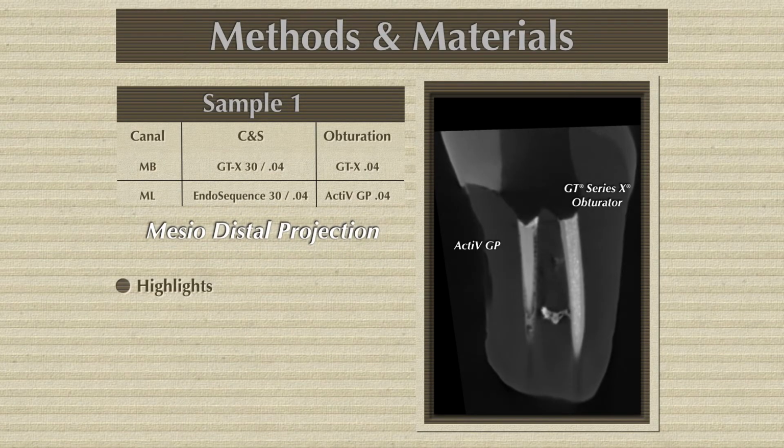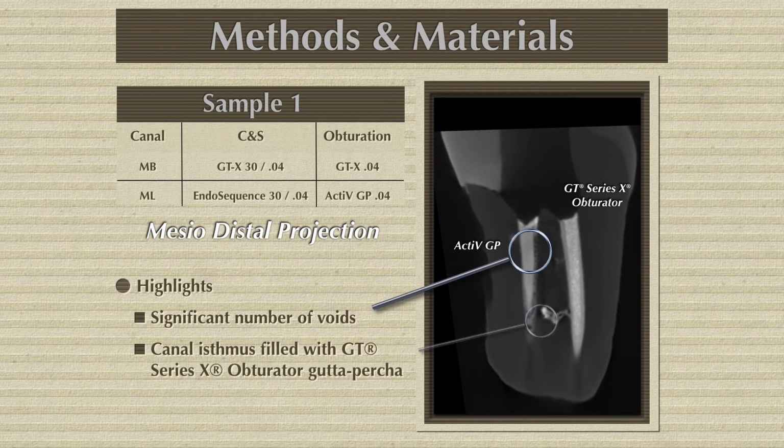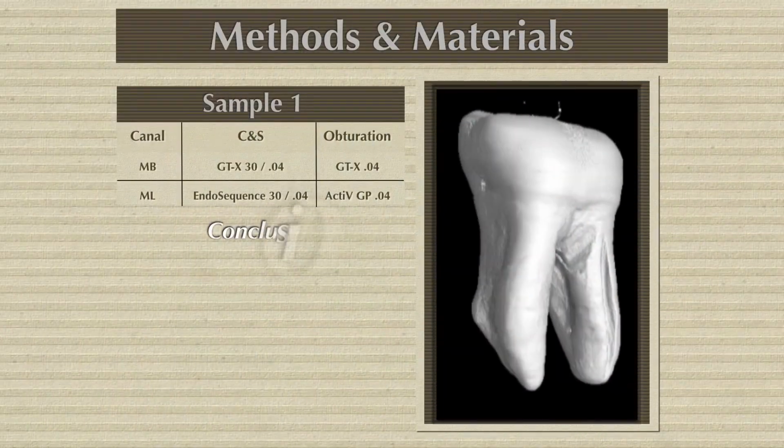It is clearly here. On the right, you can see the GTX series, which is the Thermafil, zero voids, and how the material is trying to fill that isthmus. And on the left, we have the active GP, which is full of voids, but we do not see this on an x-ray.